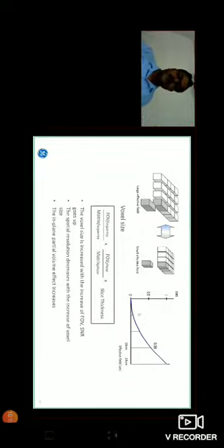So this is the relationship of FOV and SNR. As I am increasing the FOV, the SNR also increases, and we can calculate the voxel size easily to maintain or obtain good SNR images. So this is the mathematical formula to calculate the pixel size or the voxel size.